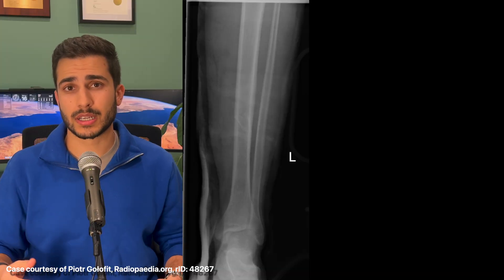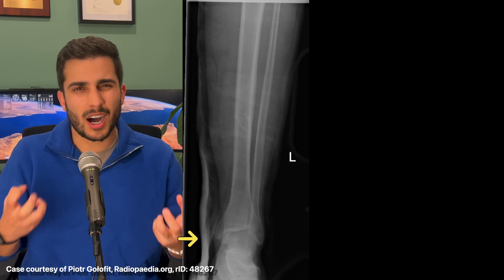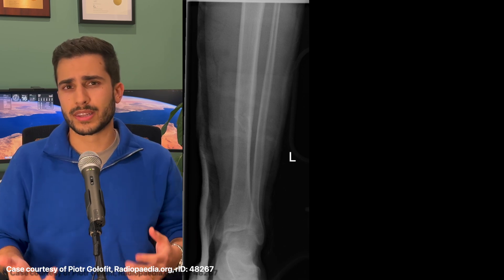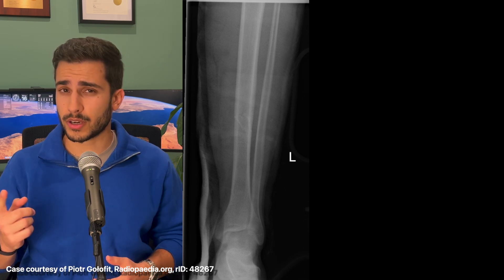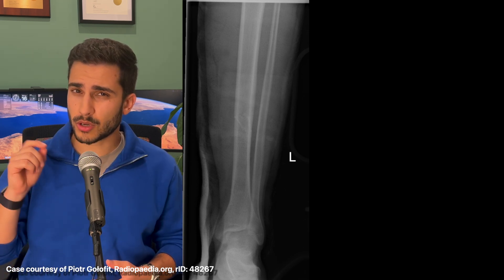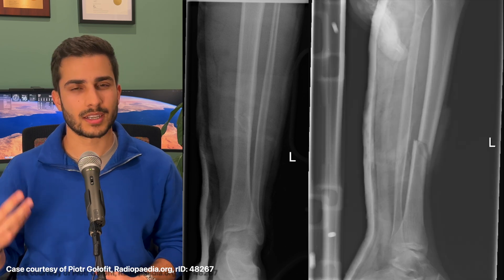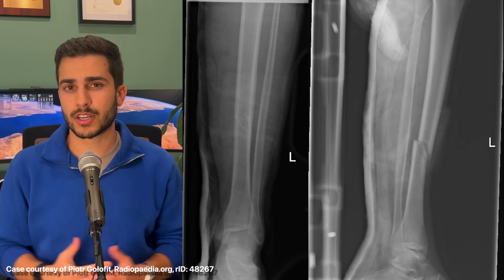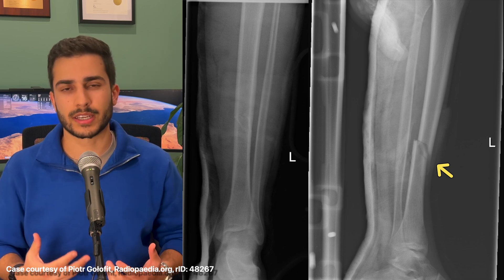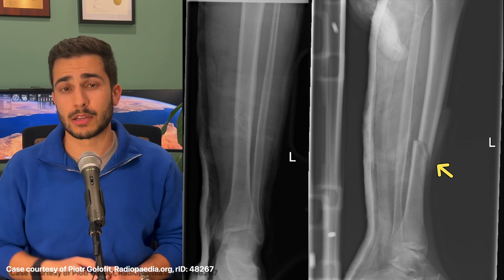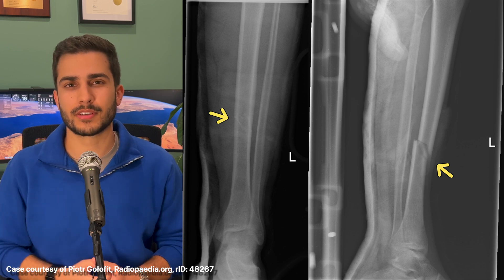Here's an example of an oblique fracture, again looking at the tibia. The patient has some kind of half cast or brace on their left tib-fib x-rays. It's actually quite difficult to spot on the AP, so looking at the lateral it's now quite obvious. The oblique fracture goes through around the middle, more towards the distal portion of the lower leg. With hindsight you can identify it on the AP as well.